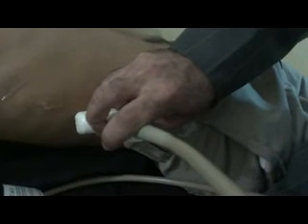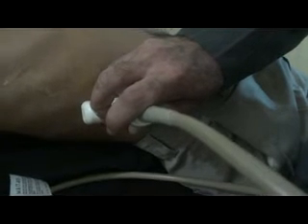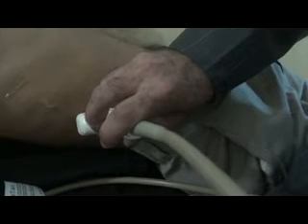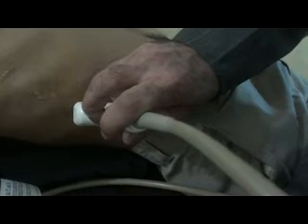Normally the renal parenchymal echogenicity should be less as compared to that of the liver. Here the liver echogenicity is lower, whereas the renal parenchymal echogenicity of the right kidney is more compared to that of the liver. Its size is relatively small — it measures 6.3 cm in length and 2.7 cm in anterior-posterior diameter.